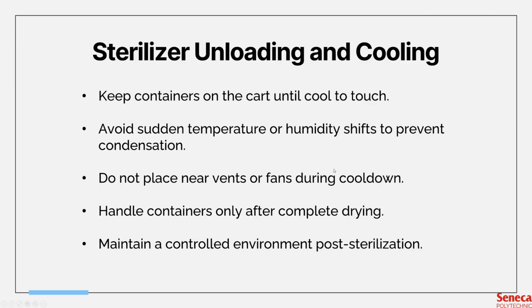And so there's also unloading and cooling. Once the cycle finishes, you have to leave the containers on the sterilizer cart until they're completely cooled to the touch. You never try to speed up cooling by using fans or opening vents, for example. Rapid changes to temperature can actually cause condensation inside the tray and container. You have to avoid placing containers near cold walls, vents, or air currents.